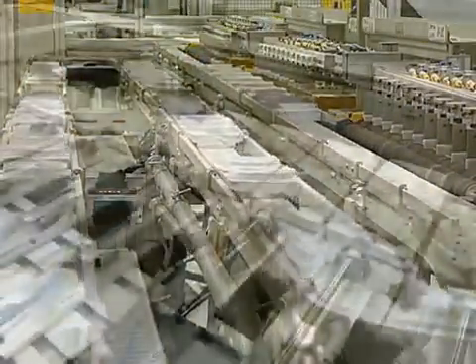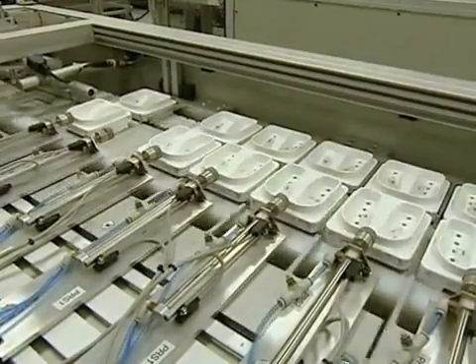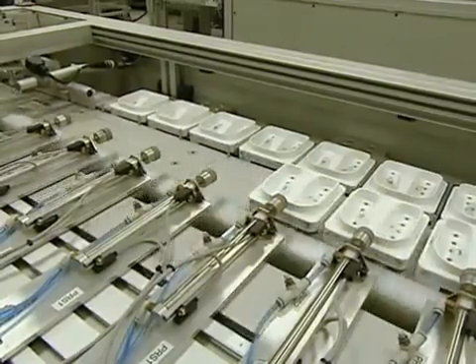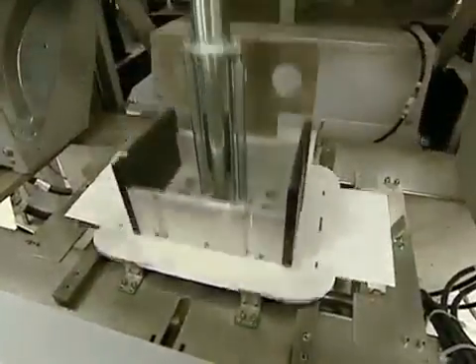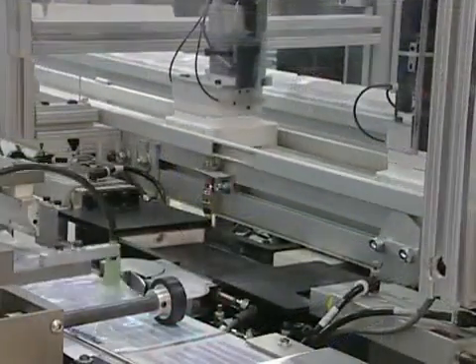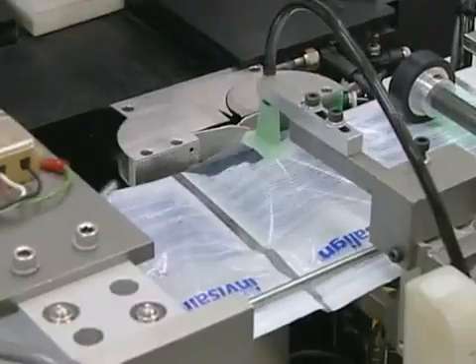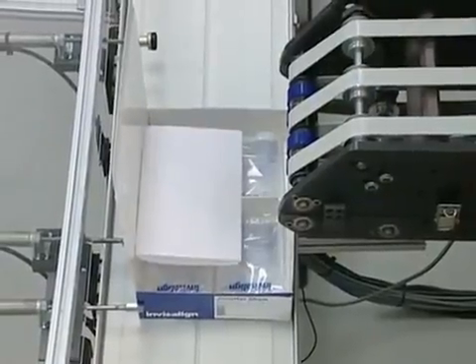In the sequencing stage, the system places the aligners into the correct treatment order and re-verifies the sequence. The final step in the process is packaging, which is also fully automated. Our equipment assembles only the boxes needed for the cases on the line and inserts the treatment information forms automatically. The system identifies which patient group is coming in, pulls up the aligners, puts them into sealed bags, verifies the data once again, and automatically prints any IPR and attachment data and places it in the box. A tamper-proof seal is applied and the case is ready to ship.